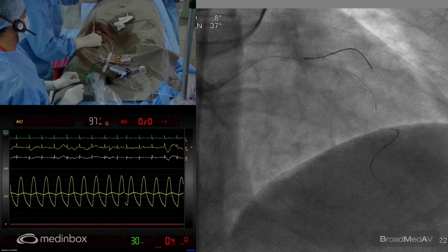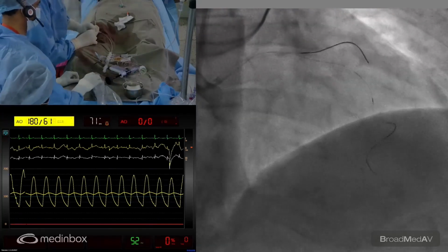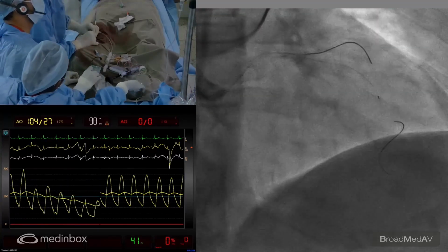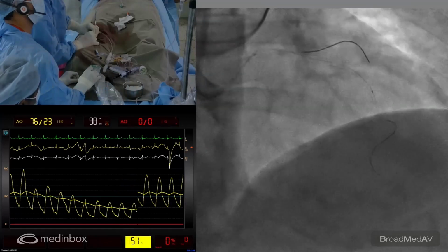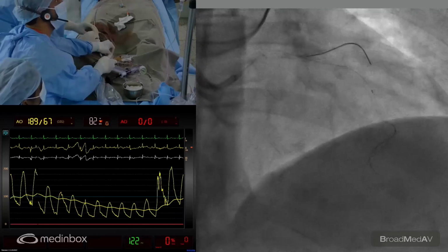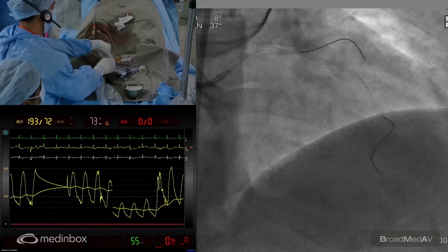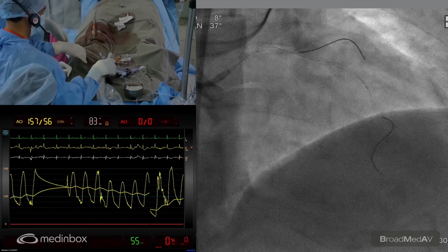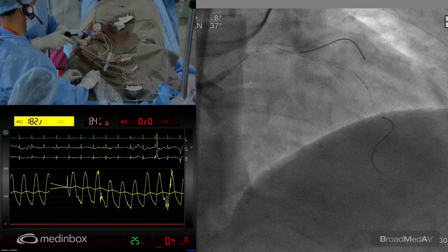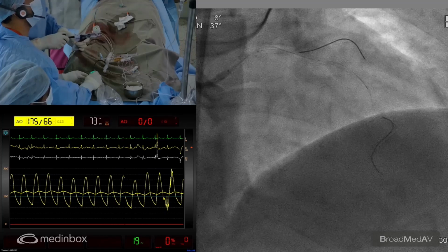As you know, these balloons are very, very bulky balloons, and going in and out is a bit of an issue, but let me hope I can get this down again. Okay, we got it back in. Yeah, went in. Okay, small check. Okay, a little bit further. Okay, that's good. Okay, now we're going to go up again. Okay, so I'm going to go up full again, so we'll give the entire 10 cycle this time.